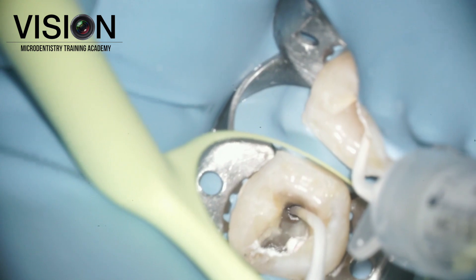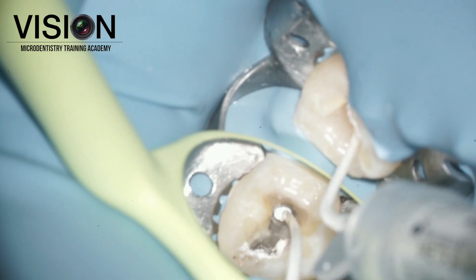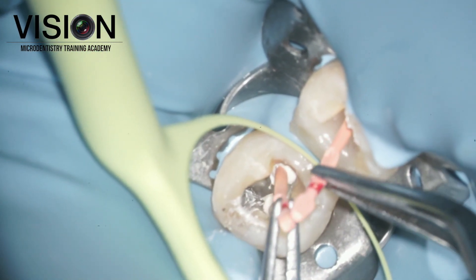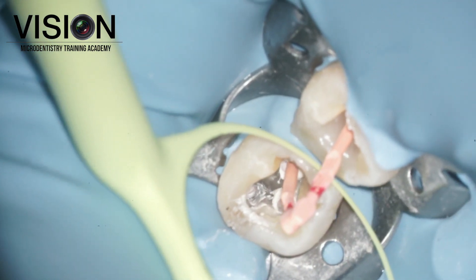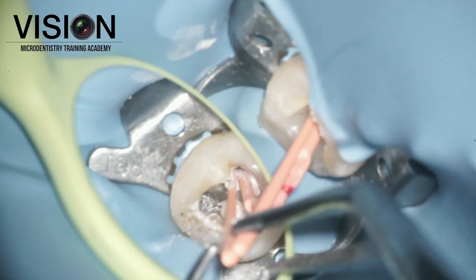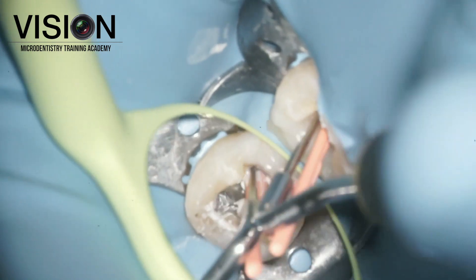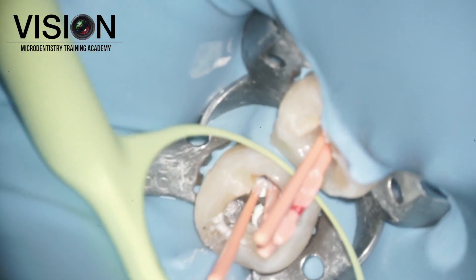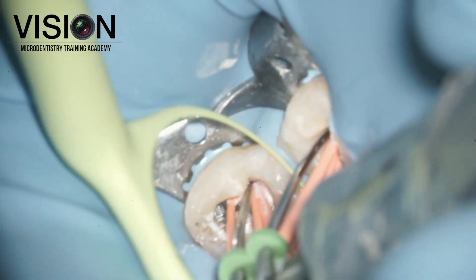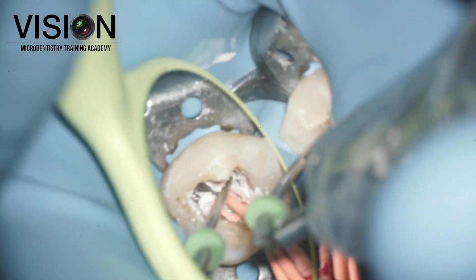The other canal was filled till the orifice level, followed by obturating the distal canal. We used a slightly modified technique — a single cone placement. Since the canal was slightly wide oval, we decided to do lateral compaction and also added some additional accessory cones to fill up the rest of the space. That was followed by searing of the gutta-percha at the orifice level, completing our obturation.